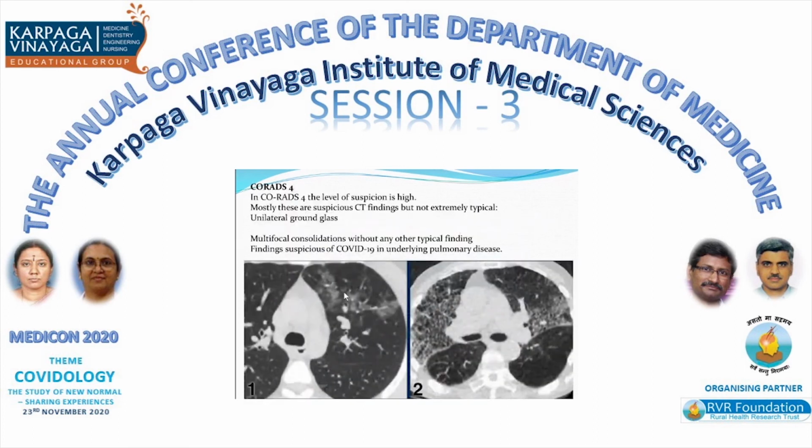For example, in this case, if you have a unilateral case like this, where there are ground glass changes, they are not bilateral, they are not subpleural. But still, whether you can really rule out COVID, we don't know. So this poses a clinical dilemma. For example, if this is a kind of patient and he wants to undergo surgery, like we had one case, a female who got these changes, and she has to undergo a left ovarian cyst operation. Now with these changes, can you be sure that it is COP and not COVID?